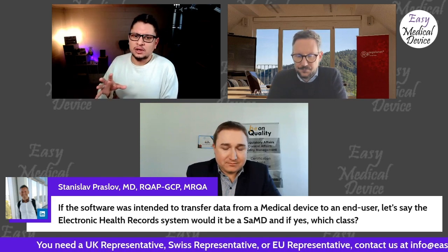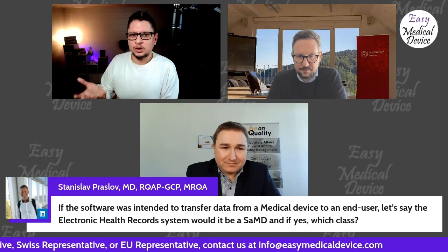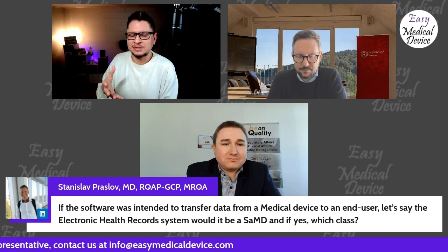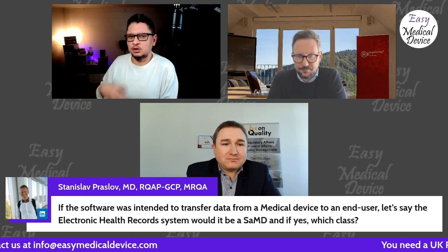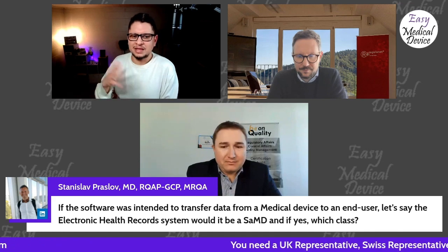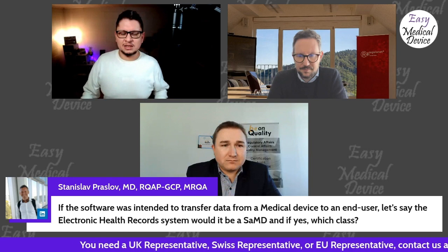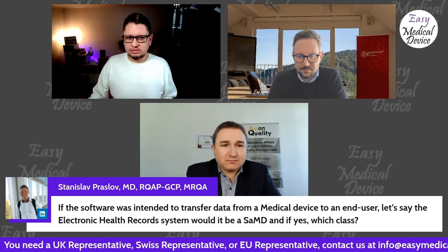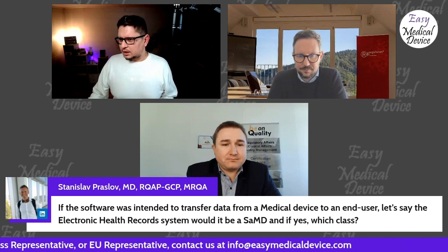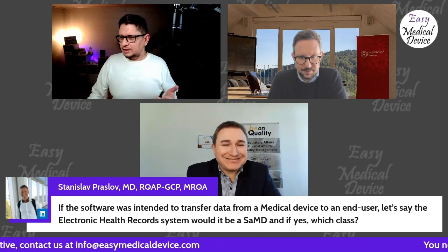I mean, we also have a common thinking that as soon as it is software working inside a hospital or a healthcare facility, it becomes a medical device, but it's not. It's mainly the indication for use, what it is used for. As soon as there is an algorithm that makes some calculation, decision, etc., then maybe it's becoming a medical device. But otherwise, it's just not that at all. So that is something to be careful about. I have some examples. I mean, some people are asking me for examples of whether something is a medical device.